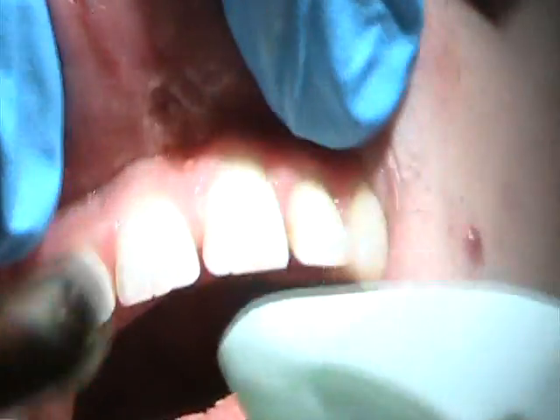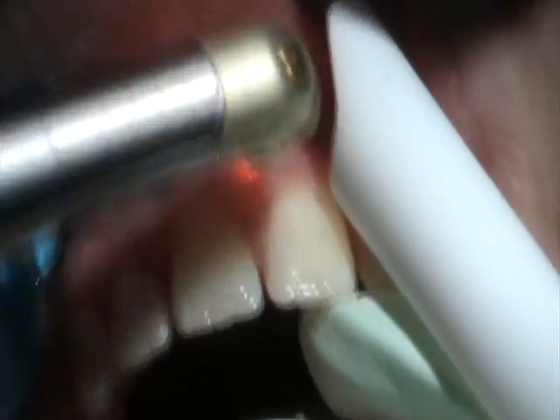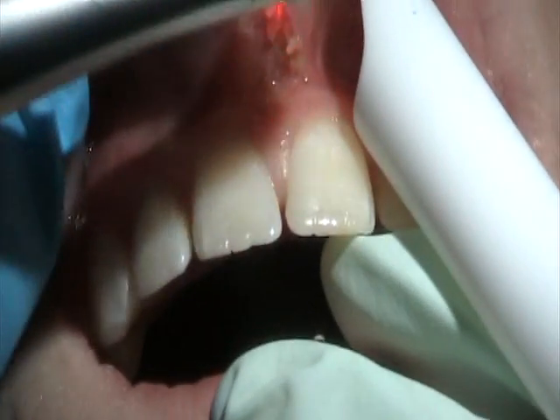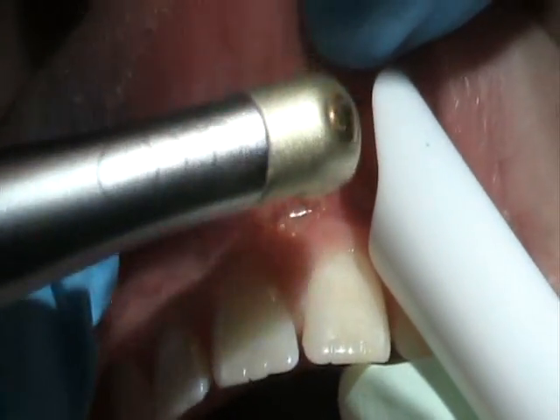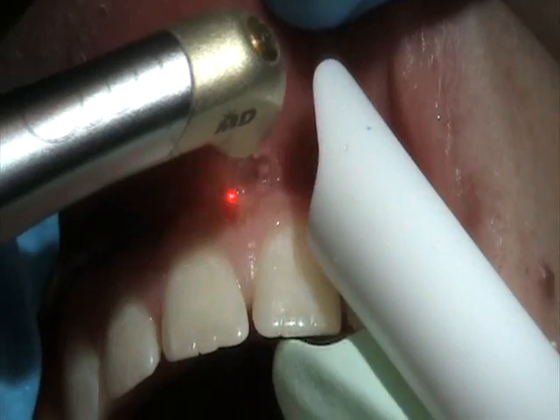What I'm doing now is I'm going back to H mode. Turn the power down about 0.75 watts. We're going to do a little laser band-aid. I just want to cauterize this a little bit before I do that last step. That's what I'm going to do at this setting. Now come this way, on H mode.